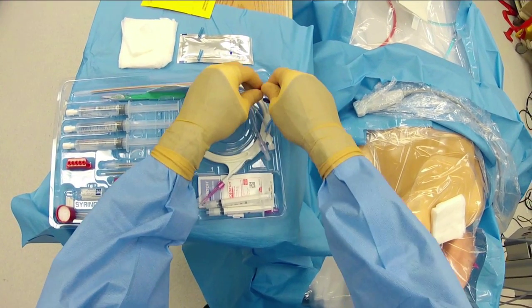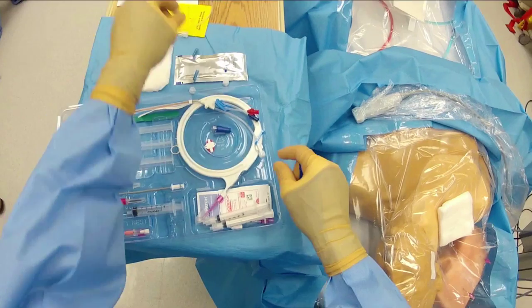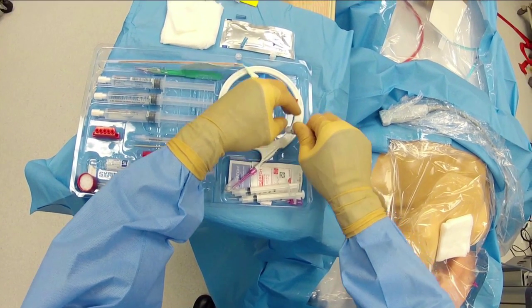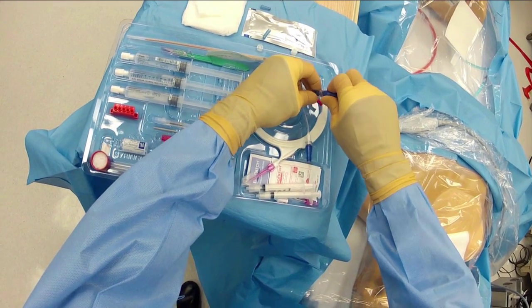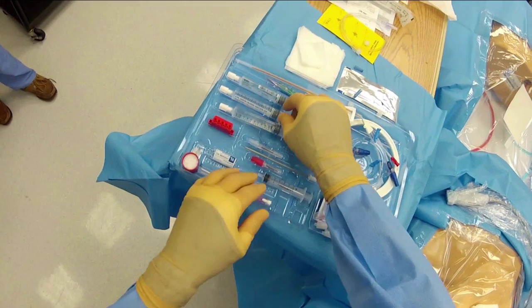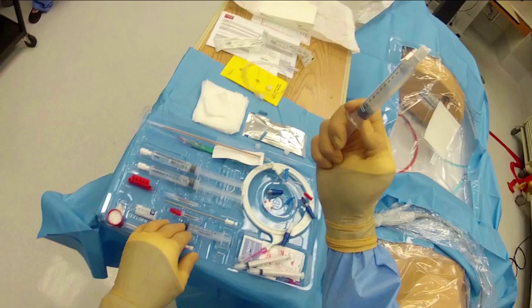We're going to get the end caps for our catheter. We remove the white caps that protect the edge of the catheter to prevent anything from falling in during shipping. Now we place the caps on two of the three ports — we cap the blue and the white port, the proximal and middle port. We leave the red cap, which is the distal port, open so that we can thread our wire through it.